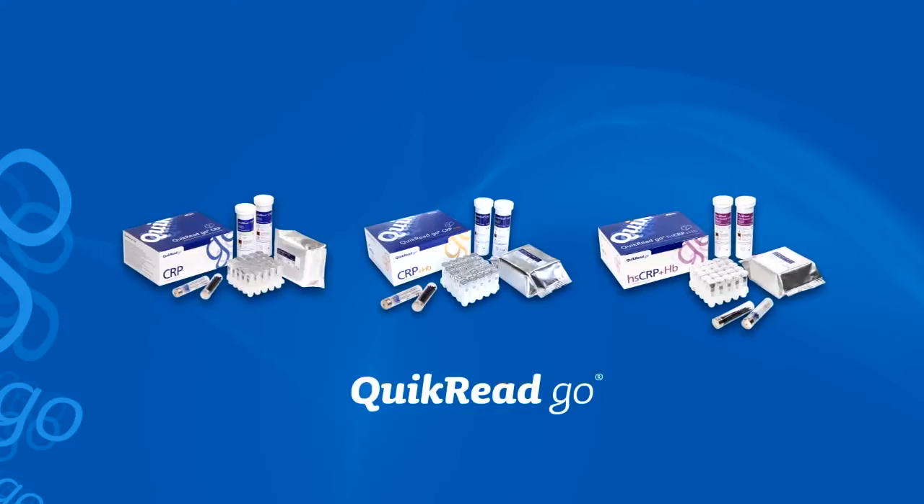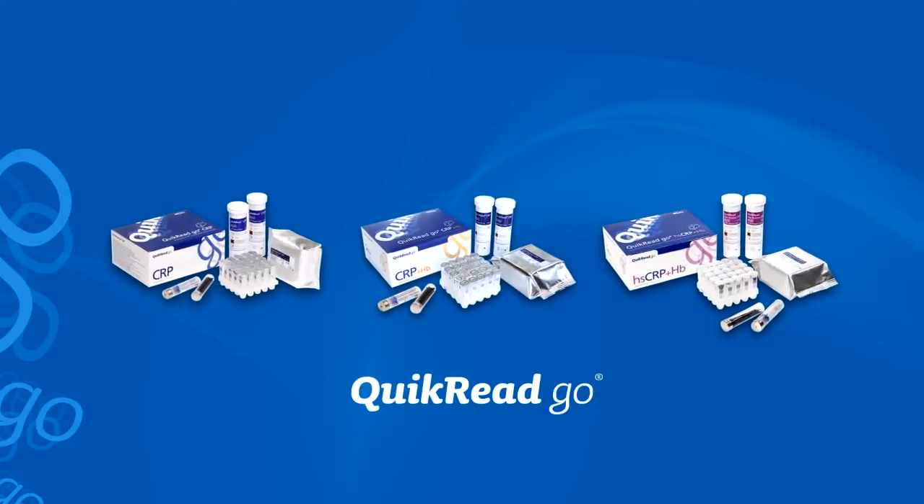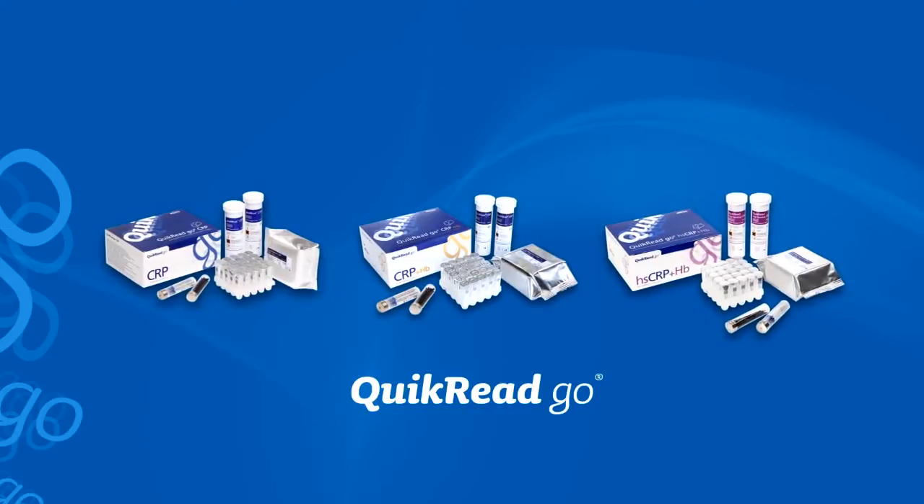Aurean Diagnostica offers a range of CRP tests for the Quick Read Go instrument. This video demonstrates the use of the tests with the Quick Read Go instrument.